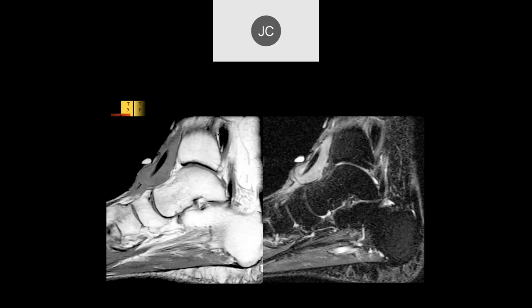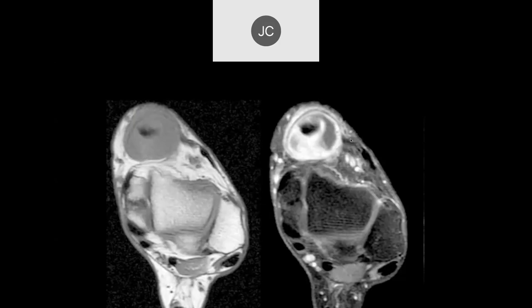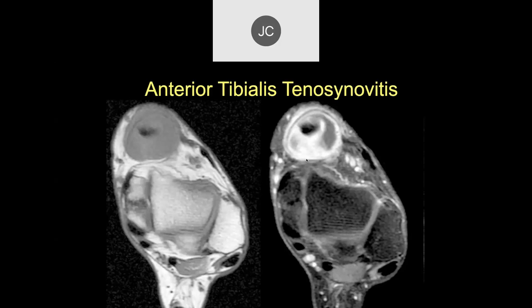There's a lot of tendon sheath thickening and fluid where the marker is. On axial images, there's marked tenosynovitis. There's a large amount of fluid within the tendon sheath, which shouldn't be this large — probably a chronic condition to allow this degree of enlargement. This is anterior tibialis tenosynovitis. There's also increased signal and thickening of the tibialis anterior tendon just in front of the joint, concerning for tear.